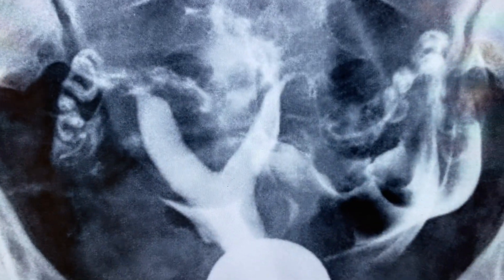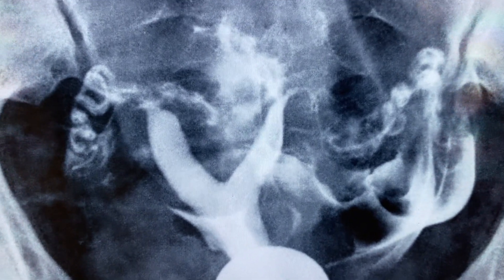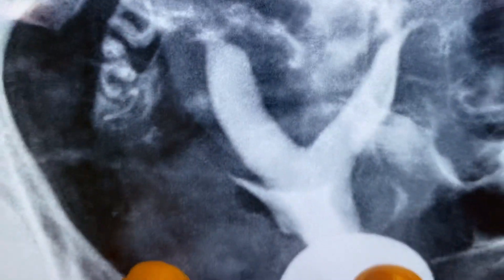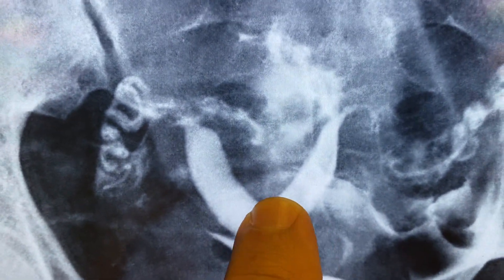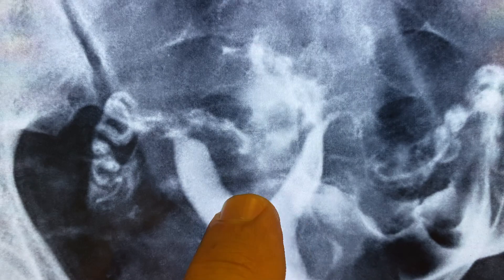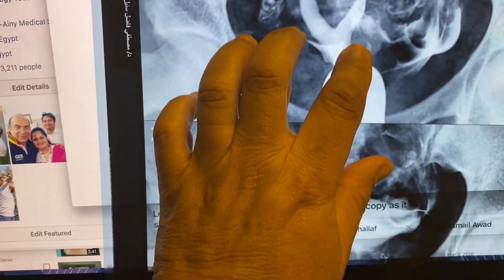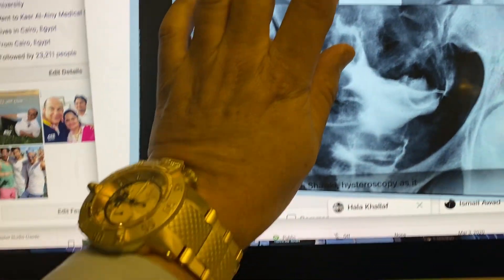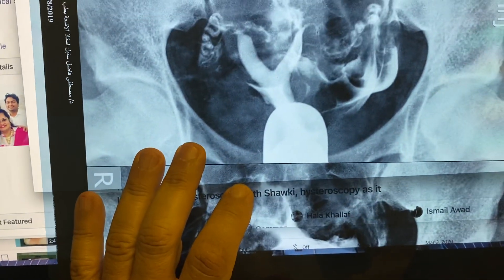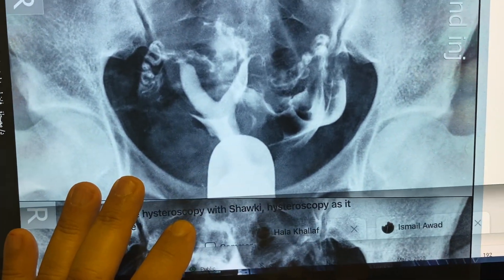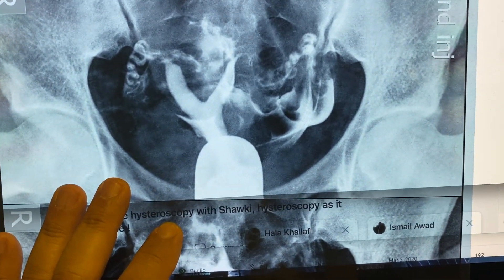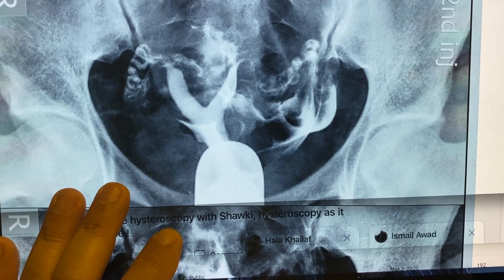If you pull the cannula a little bit out, you can see two cavities of a septum. The angle between both cornua is less than 90 degrees, so that is a uterine septum. It's very obvious and indicates hysteroscopic metroplasty.